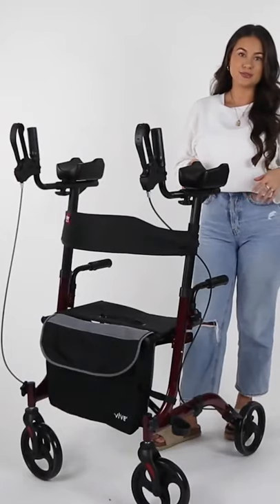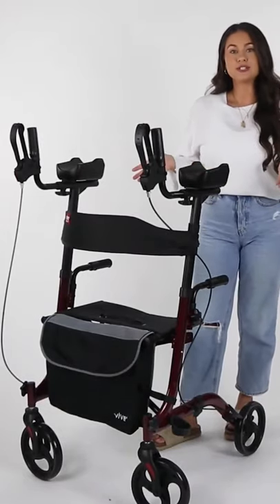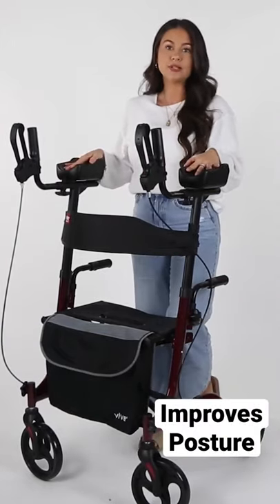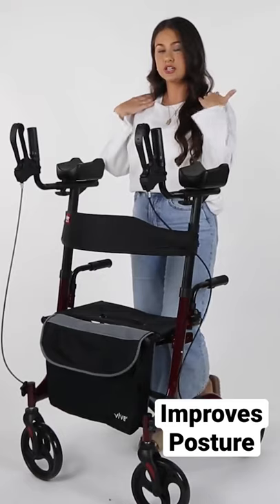Hey, I'm Alexandra and I'm a sales rep here at VIVE Health. Today I'm going to be showing you the upright walker. This is great for improving posture and aids in mobility while eliminating lots of the tension from the neck and shoulders.